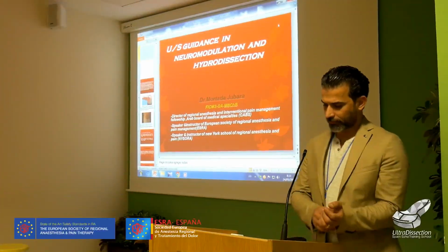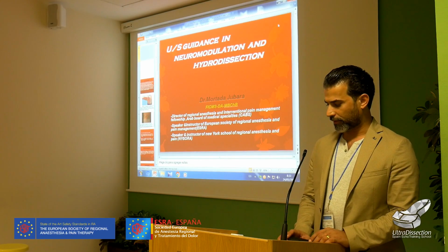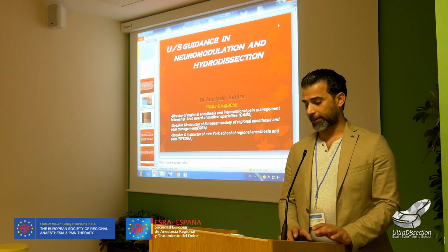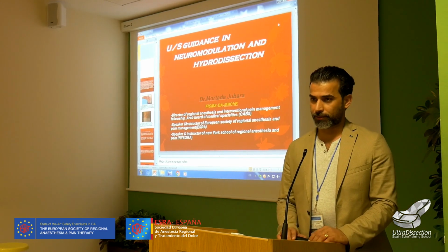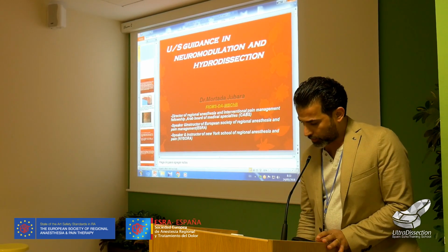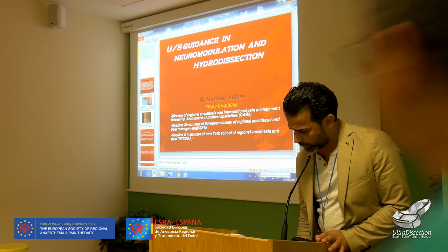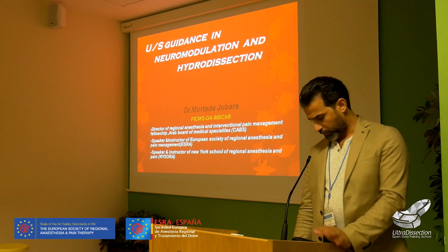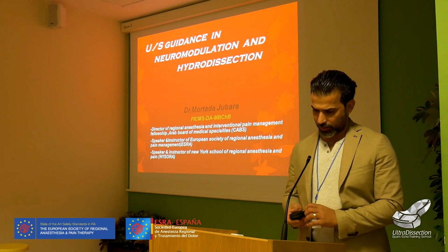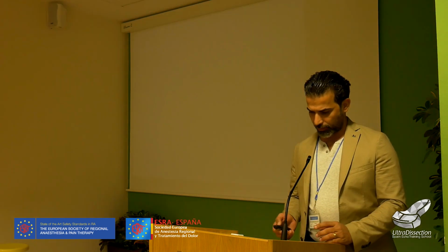Morning all. Today we have a lecture. It's different from regional anesthesia topics. Also, it is not purely pain management. It is in between regional anesthesia and pain management, with neuromodulation. So here we want to start with ultrasound guidance in neuromodulation and hydrodissection, and how to use ultrasound techniques.